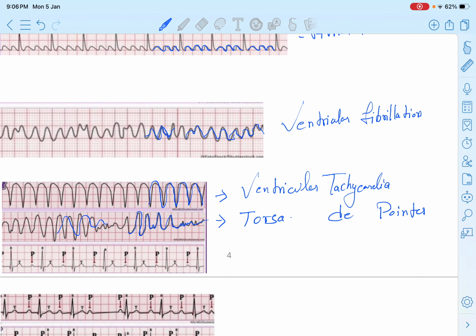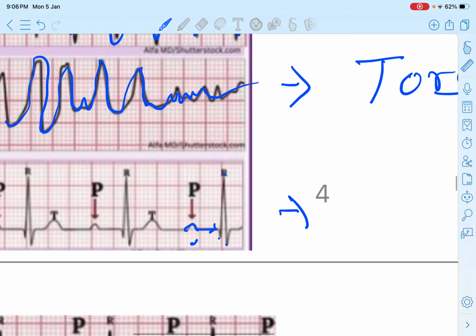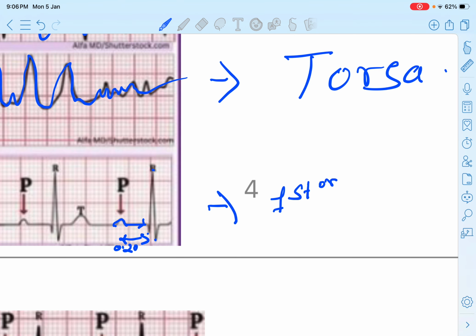Okay, now tell me which type of graph is shown. Here the P wave, huge and wide, again Q, again R, again S, and T. If the PR interval is more than 0.20 seconds, that is called first degree heart block.